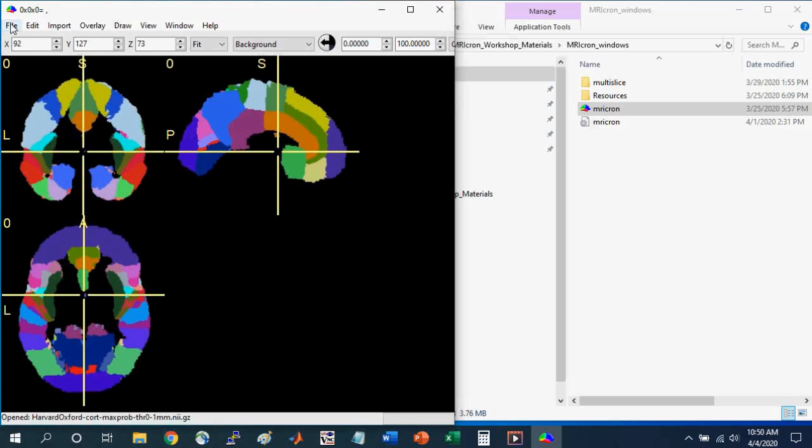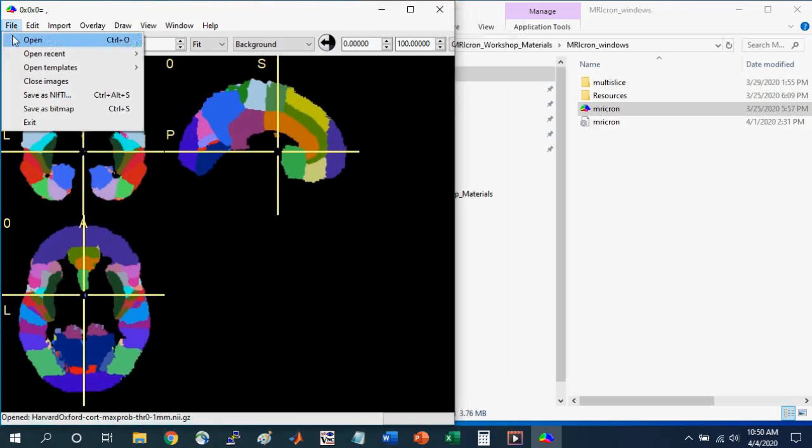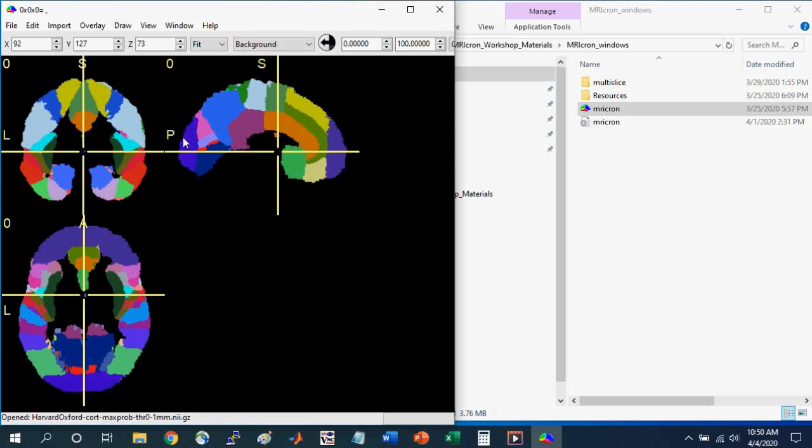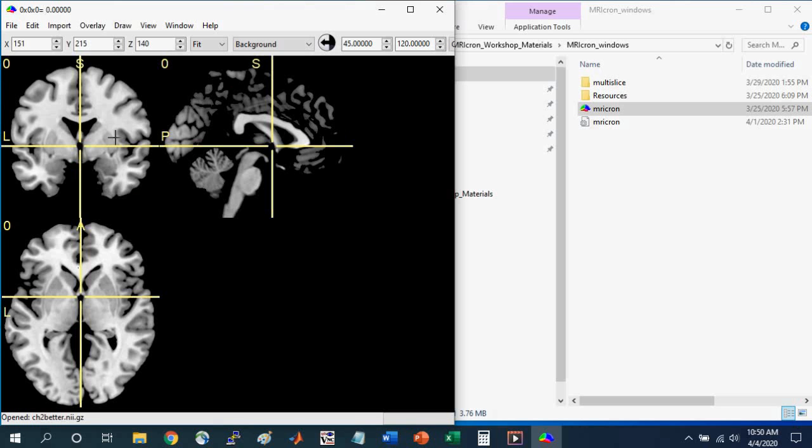And so I'm going to first open a template brain. So I'm going to go to File, Open Templates, and select CH2 Better. And this is the standard brain in MNI space that can be used to overlay different anatomical atlases or statistical maps. So see the Introduction to Brain Navigation with MRI-Cron tutorial to learn how to get the settings that I have here and learn what these different parameters mean.